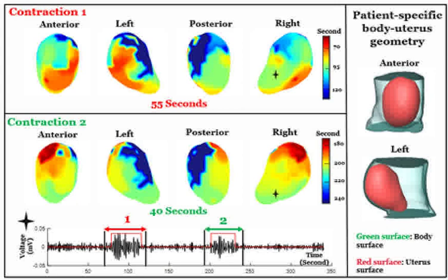These data are then combined and processed into three-dimensional uterine maps, with warm colors denoting areas of the uterus that are activated earlier in a contraction, cool colors indicating areas that are activated later, and gray areas showing inactive regions. A sequence of maps is generated over time, creating a visual time-lapse that shows where contractions start, how they spread and synchronize, and potential patterns that are associated with a typical pregnancy versus one with complications.